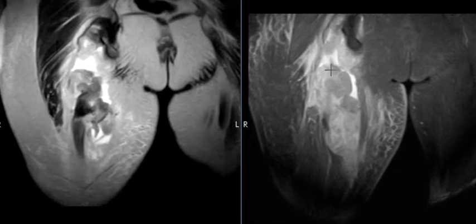This is another view where fluid stands out bright, all the same as this one. You can see the fluid, these intermediate irregular areas, amorphous regions of intermediate signal, and lobulated. These are all clotted blood products in here. And this is that muscle that's pulled down. They also have a tear, excuse me, of this right here.